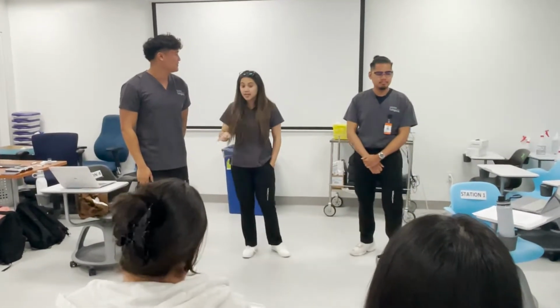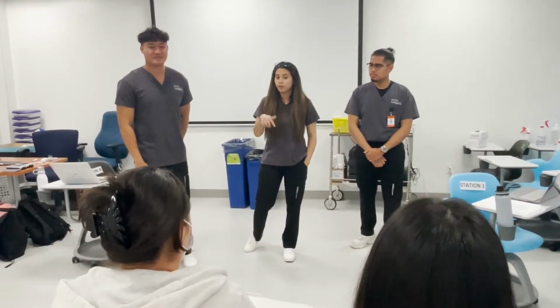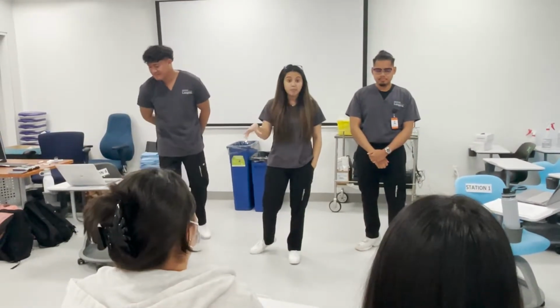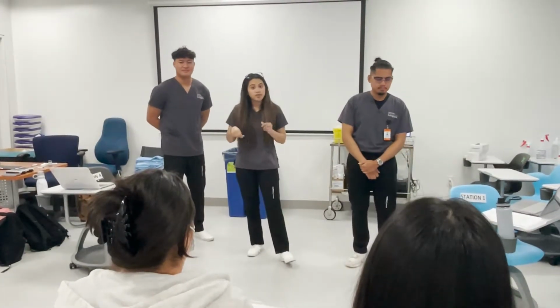Now that we've talked about our plan, we want to make sure we know what your goals are. What would you like to get out of today? I would like to know how to manage my blood sugar properly. Oh, I think I do too. Yeah, me too. We're also not going to be touching on how to use and inject insulin for this class. That'll be our next module, but we want to keep things nice and short today. So we're just going to focus on the glucometer.